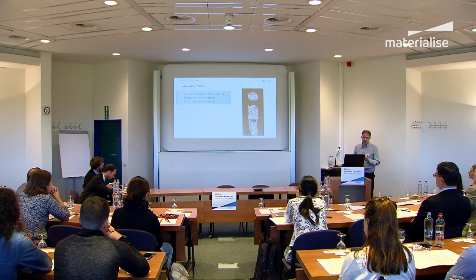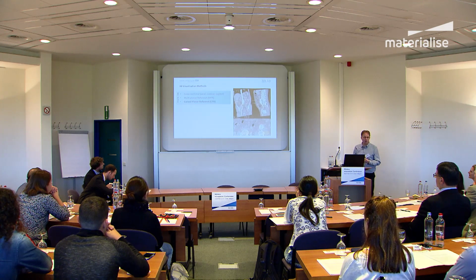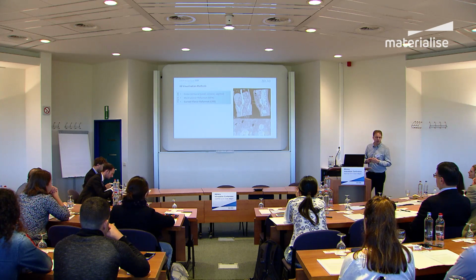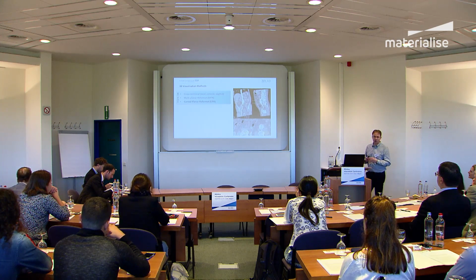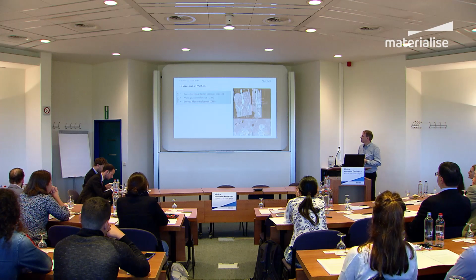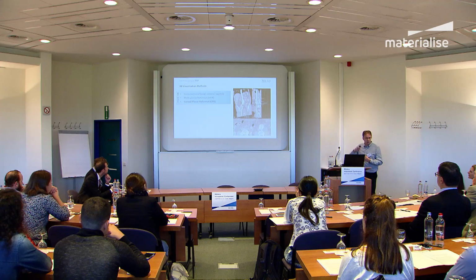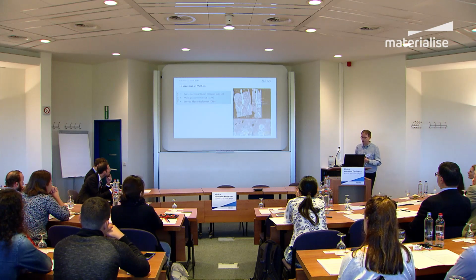And if that feature that we're trying to identify is curved, then maybe a curved plane reformat is more appropriate, such as trying to measure the diameter of a vessel by automatically extracting the center line along the vessel. Then all the cross-sectional views are perpendicular to the axis, and so we can measure true diameters of the vessel. And we can create a straightened view of it and then measure the profile of the diameter of the vessel more accurately.